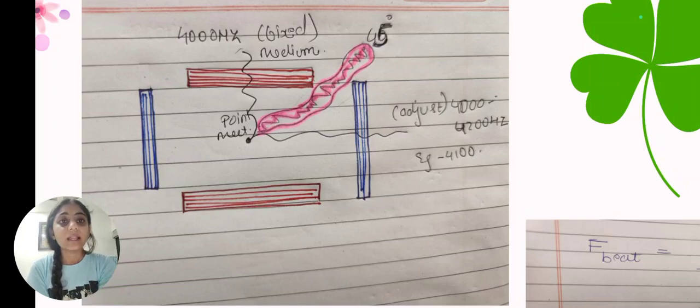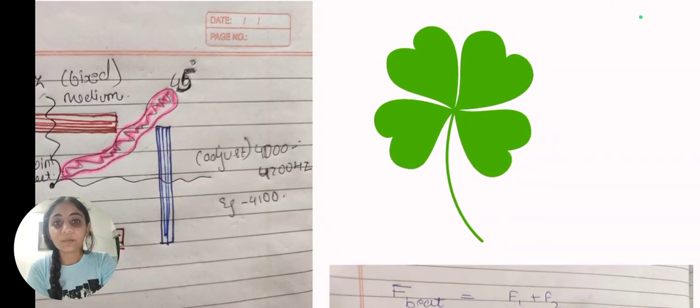Okay, and these two frequency currents interfere at a 90 degree, and the beat frequency current is rising at a 45 degree. So like this, in medium 3 and medium 4 it will happen. So it will turn into a clover leaf pattern.